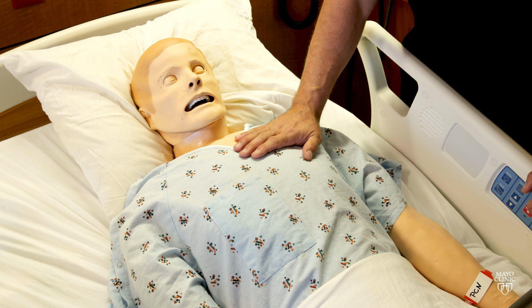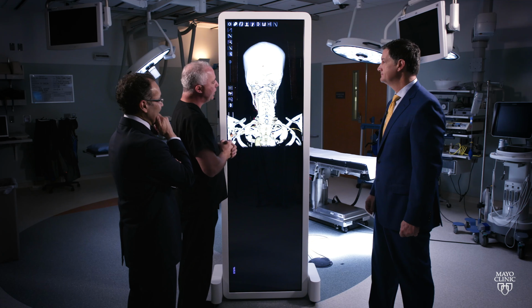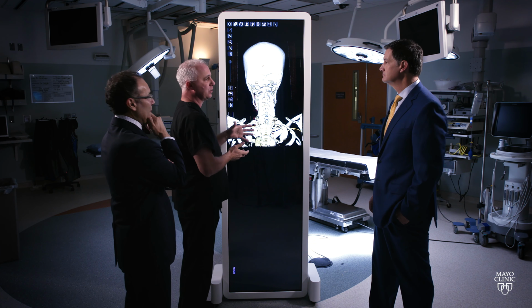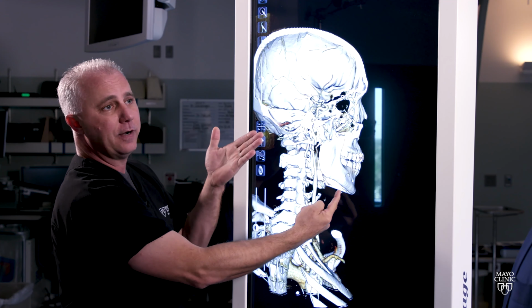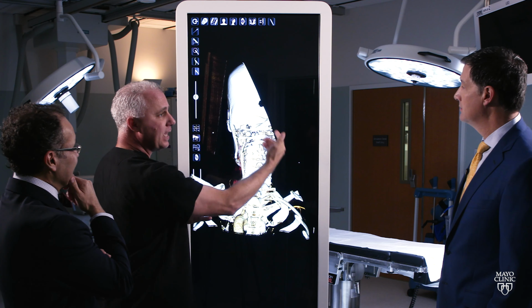Yes, sir. If I had your CT scan, it would take me about an hour and I could have your information on the table. And what it does is it takes the thin slice CTs, it stacks them, and then renders them into a three-dimensional object. We can actually take and cut this tissue and roll it open and see inside her head as well. No kidding. So in this case, everything was outside, but if Dr. Q wanted to look at, say, an aneurysm, we could actually look inside as well, and that's where the volume rendering comes in. I'm kind of blown away by that at the moment. That's amazing.